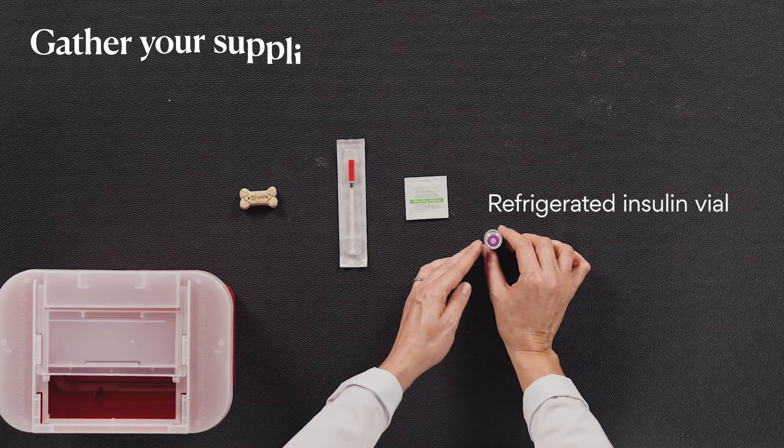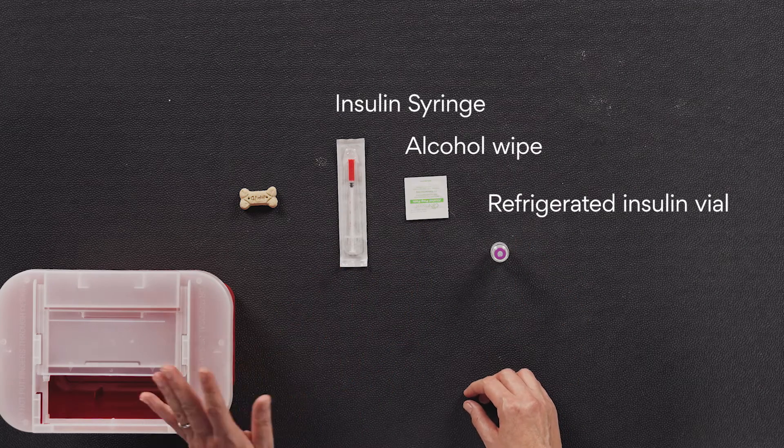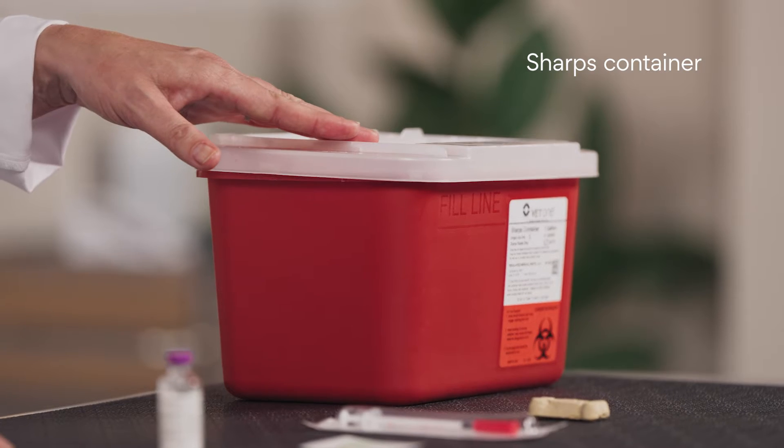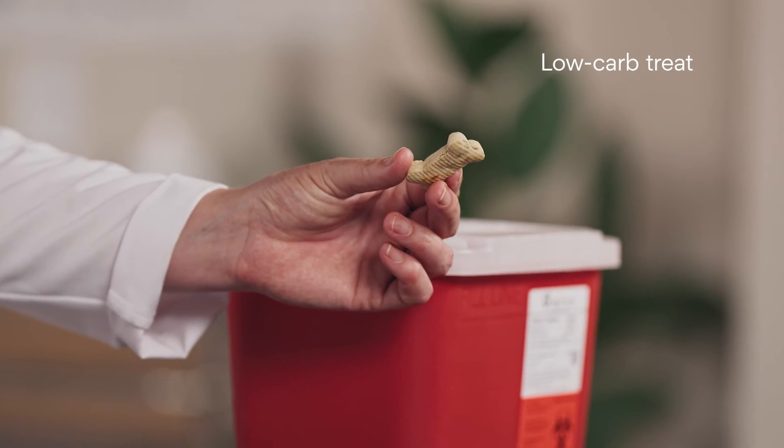First, have everything you need ready to use, including your refrigerated insulin vial, an alcohol wipe, your insulin syringe, and a sharps container to safely dispose of the used needle. It's also helpful to have a low-carb treat on hand to distract your pet while you administer the insulin.